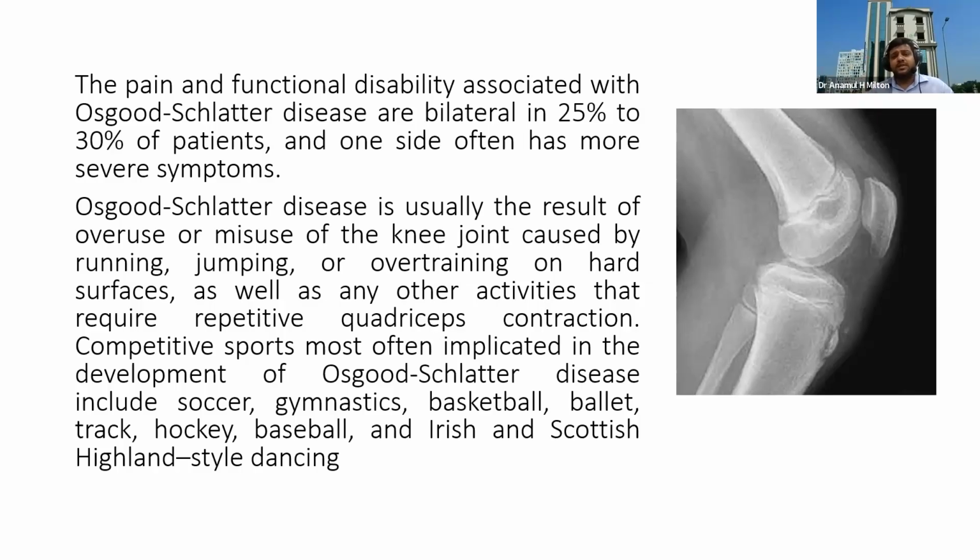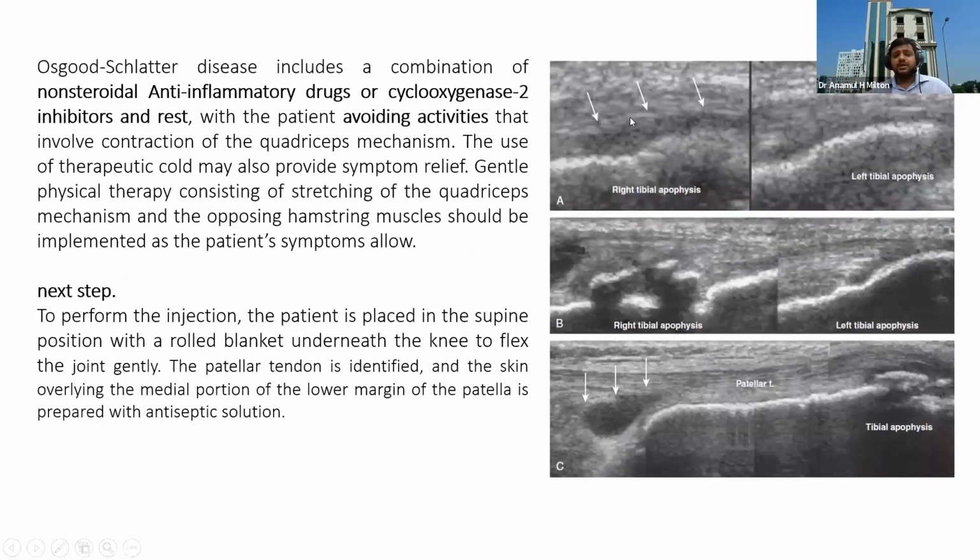Very important, sometimes there are changes of the tendon. Whether or not there are changes of the tendon, you should check by ultrasound. Okay, so we can see that there are changes. There is thickening, and the bony outer cortex has changed from baseline to the upside. With repeated trauma and the pull of the patellar tendon, the cortex is pulled out from the normal surface.